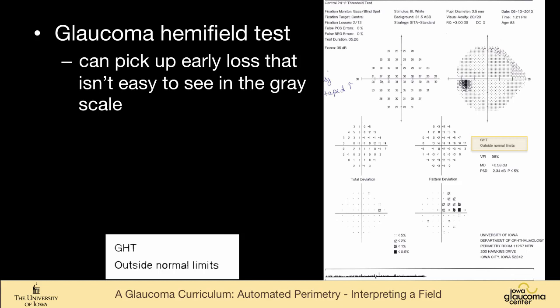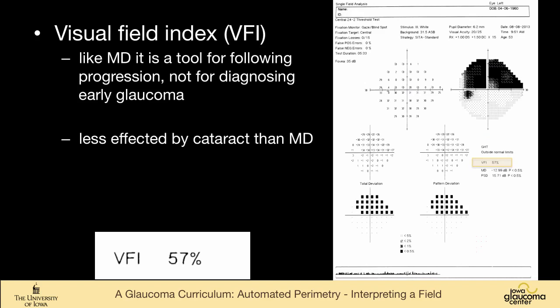Sometimes it will pick up early loss that's not that easy to see in the grayscale, like in this patient. You can see that the glaucoma hemifield test is outside normal limits. If you were just looking at the grayscale and you weren't looking at the raw data and the pattern deviation, you might miss the fact that this person has visual field loss.